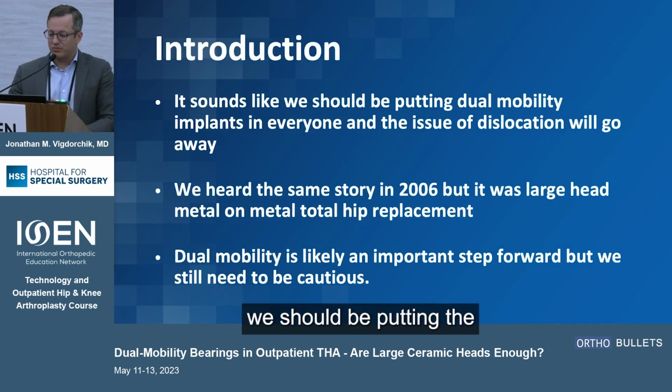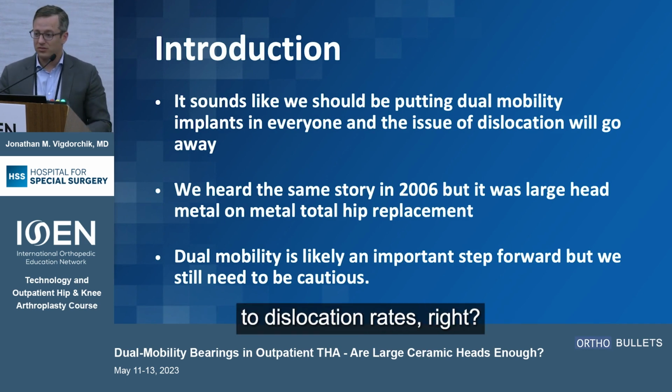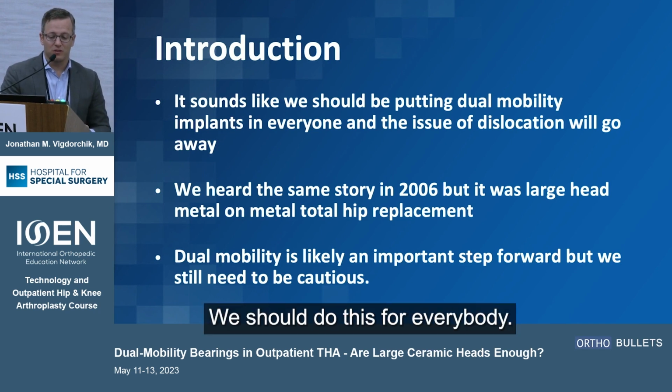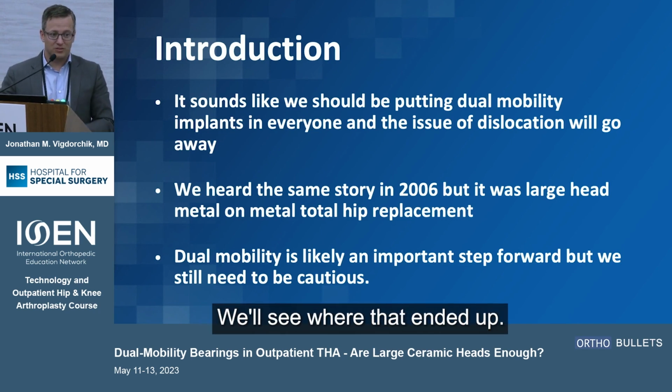It sounds like we should be putting dual mobility in everyone because it's God's savior to dislocation rates, right? Everybody doesn't want dislocation rates. There's a big push from the companies when they release new dual mobilities: we should do this for everybody. We heard the same story in 2006 with large head metal on metal, and we see where that ended up.